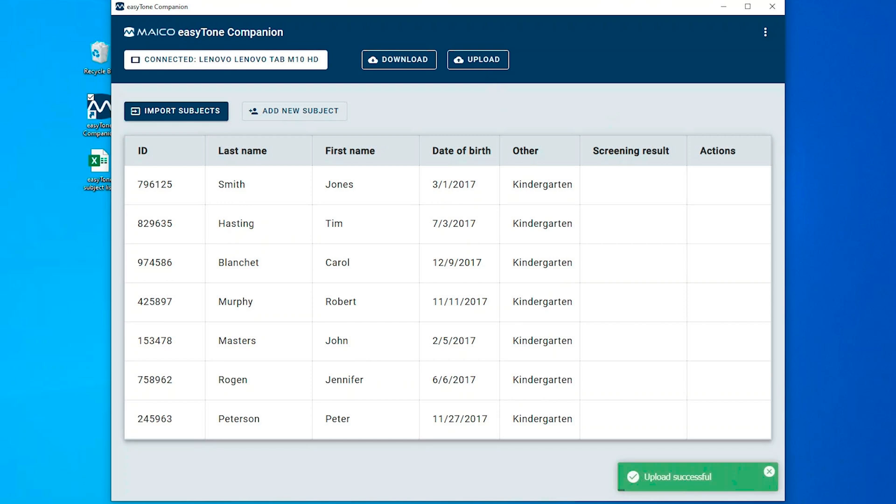In the bottom right corner, a pop-up is displayed to confirm successful upload.